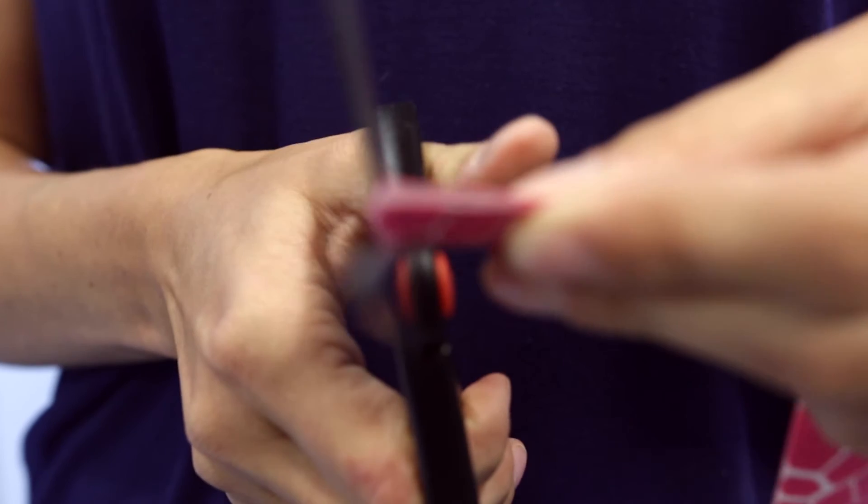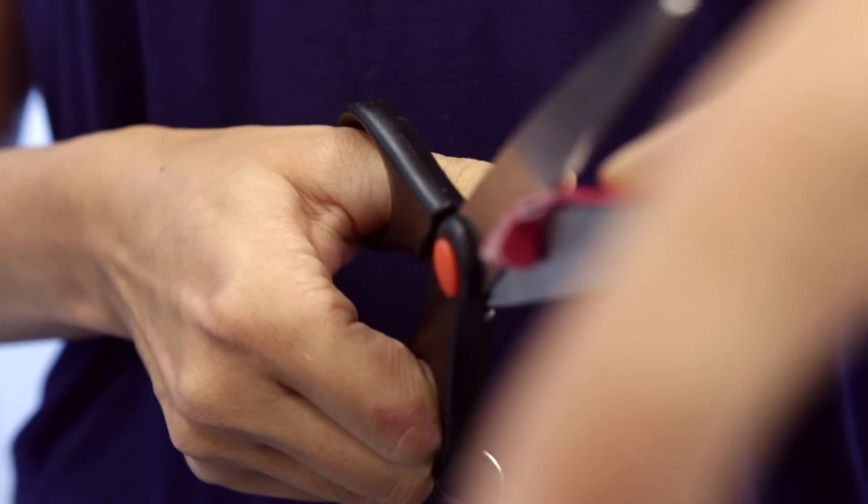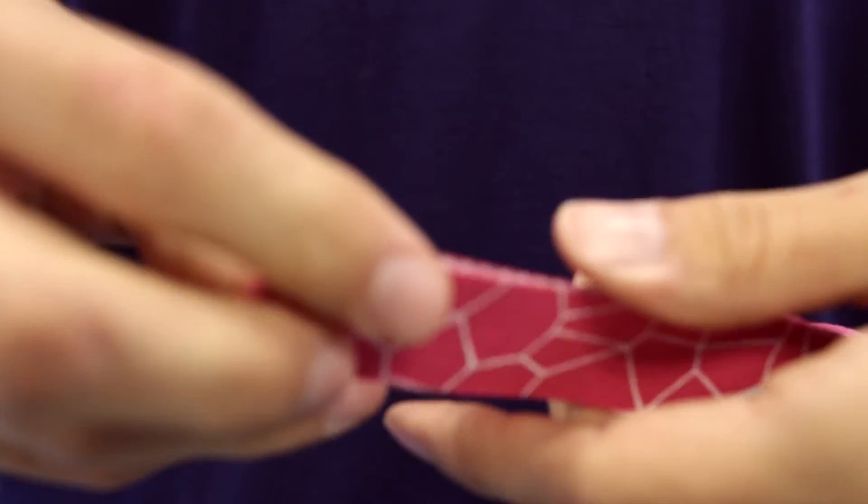I'll cut it down to about two to four centimeters from my base. Then I fold those two sides over and create rounded edges on each end of the tape.